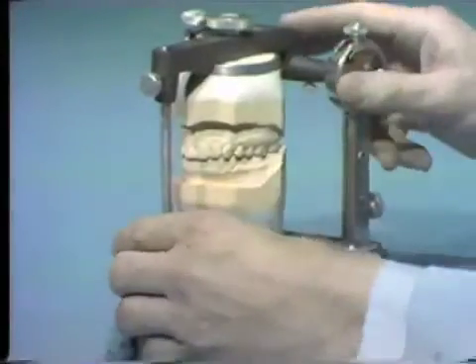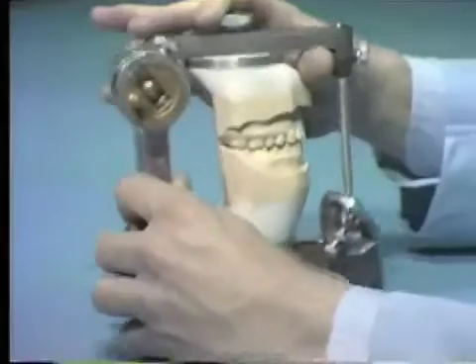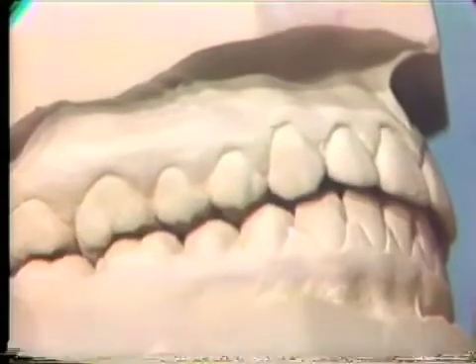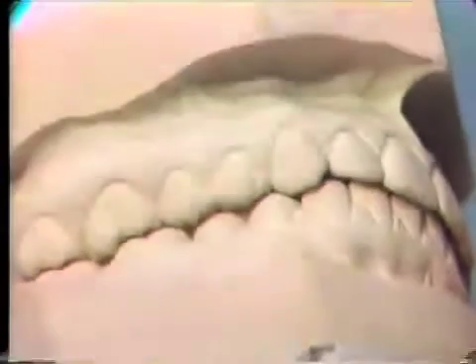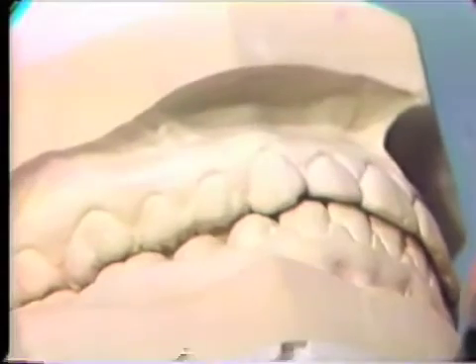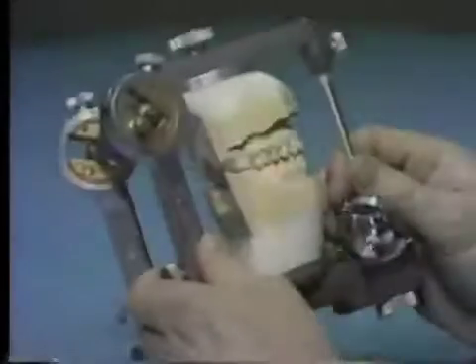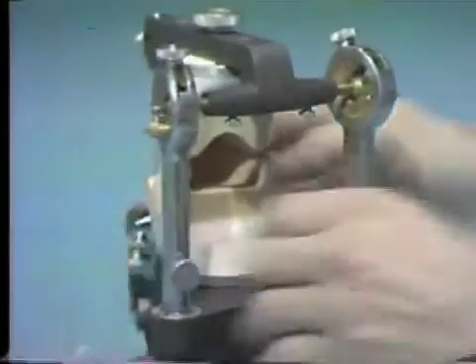Examine the individual contacts from the buccal. Lightly tap the teeth in central occlusion. Watch as the mandibular buccal cusp tips occlude with the centric stops of the maxillary teeth. The exact positions of the contacts can be seen from this view. When the occlusal stops are checked with articulating paper, there may be several marks on a tooth. If there is doubt as to which marks are occluding in centric, looking at the cast from this view permits visualization of where the mandibular buccal cusps actually occlude with the opposing teeth.